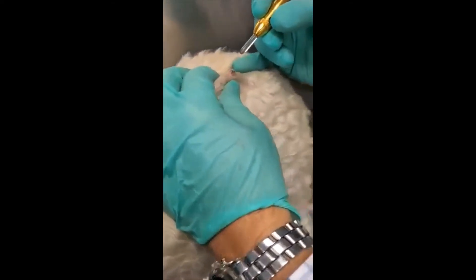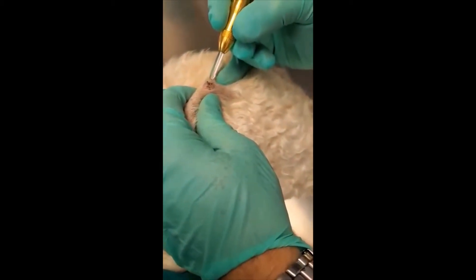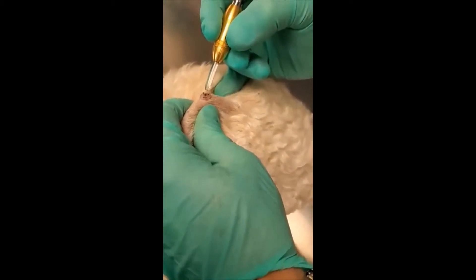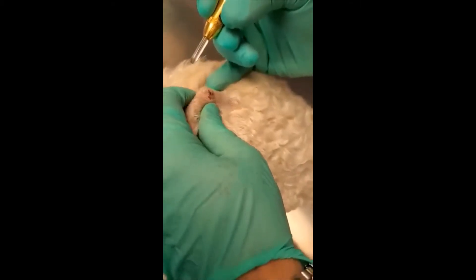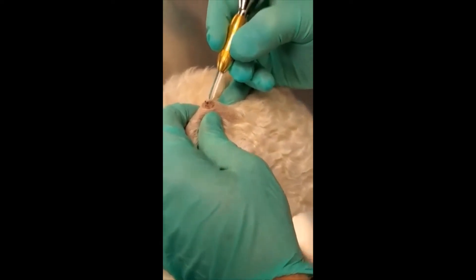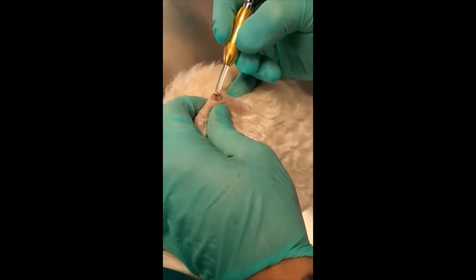We're going to, one by one, freeze these with approximately a 30-second freeze cycle, thaw cycle, and a freeze cycle again for 30 seconds. Remember, we want to make sure that we're knocking any material off of the surface so that we get good contact and quick freezing. We don't want any ice crystals building up, preventing contact.